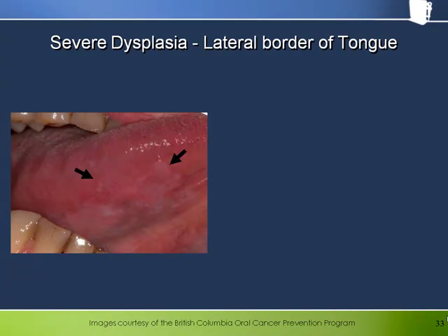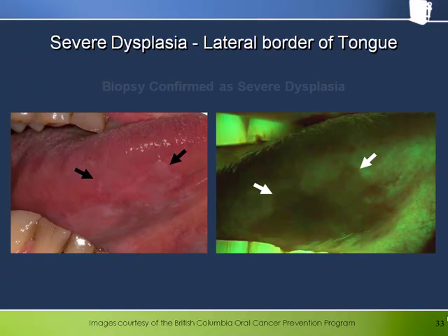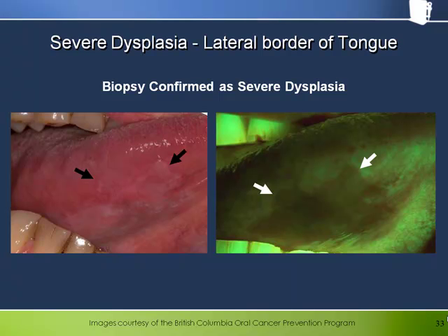Here we see another example of a leukoplakic patch, somewhat more subtle and easier to miss than in the previous example, that again is predominantly dark under Velscope despite the surface keratin. Notice the irregular and well-delineated border thrown into higher contrast with fluorescence — it would be hard to ignore this. This area was biopsy confirmed as severe dysplasia.